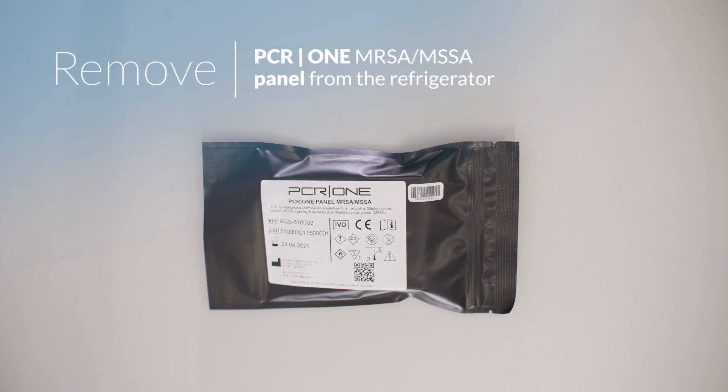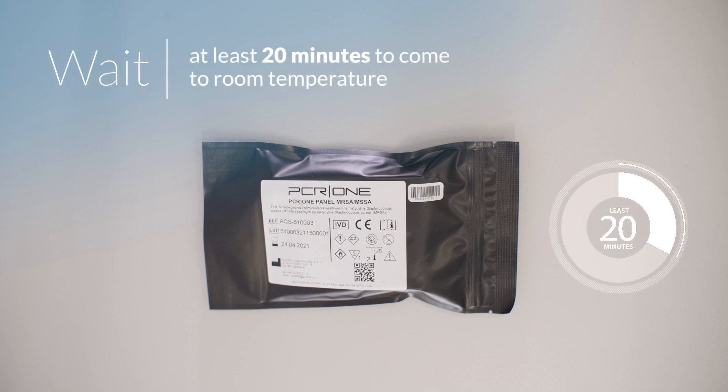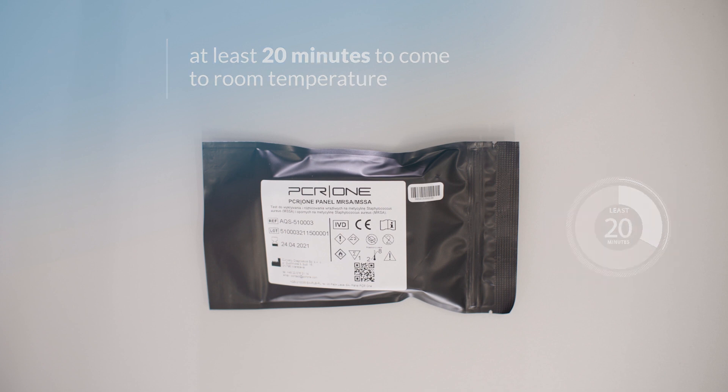Make sure that you have a pouch with MRSA MSSA panel taken out from the refrigerator and accommodated to room temperature over at least 20 minutes, laying flat with the label facing upwards.